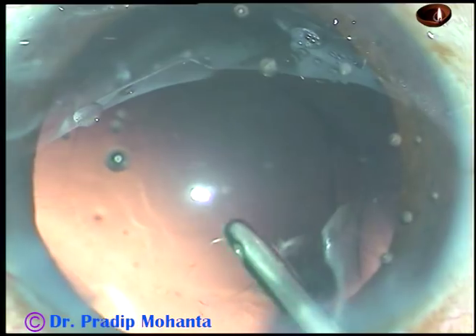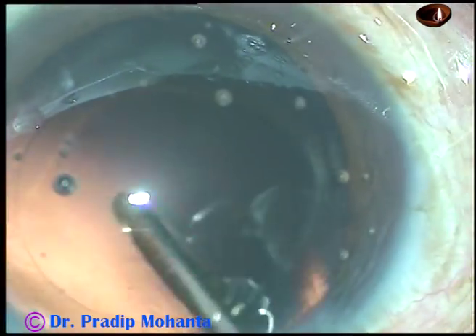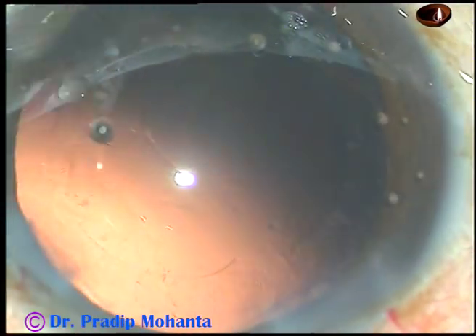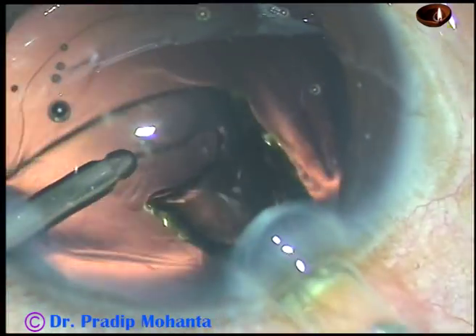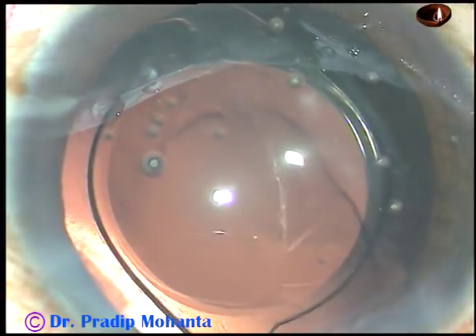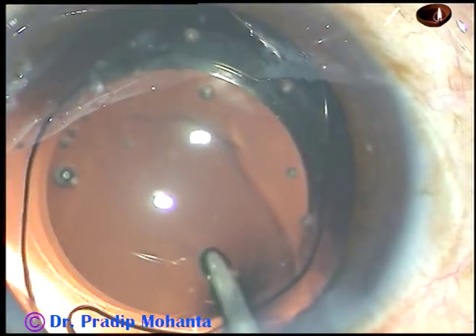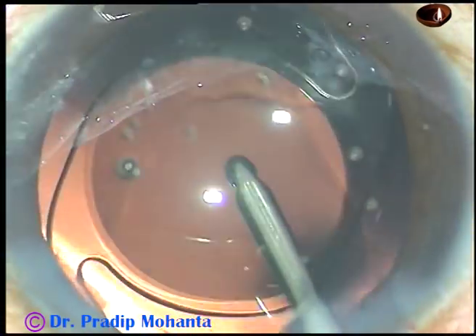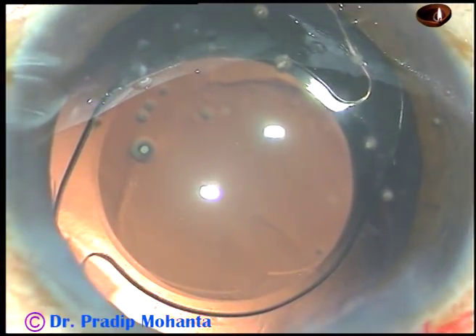And now this is hydro polish. The fluid jet is swept over the posterior capsule. And now this is hydro implantation — the anterior capsular bag is formed by BSS, using the irrigating probe, and the lens is injected into the capsular bag. The lens is then dialed by the irrigating probe and the surgery is almost done because there is no visco remaining.